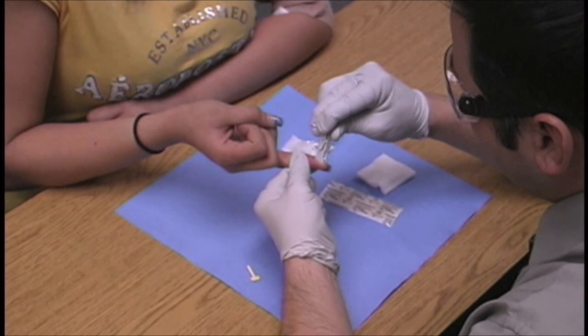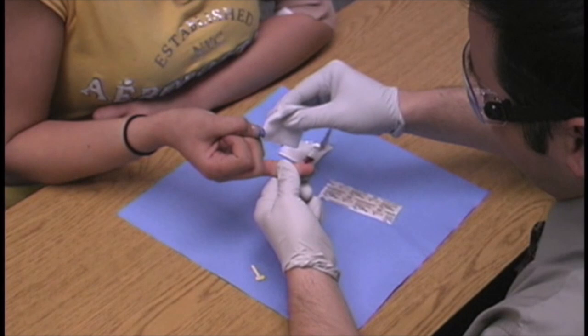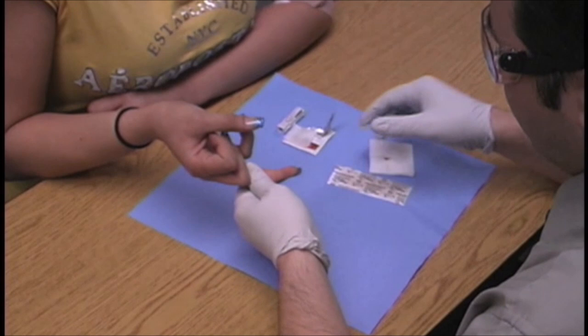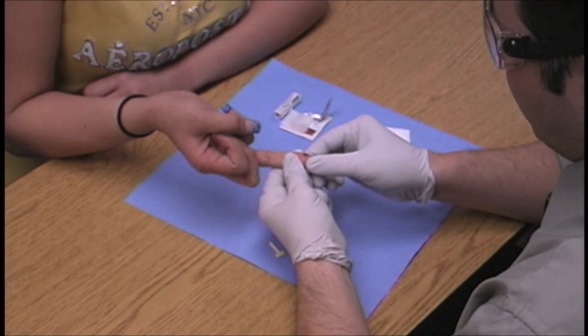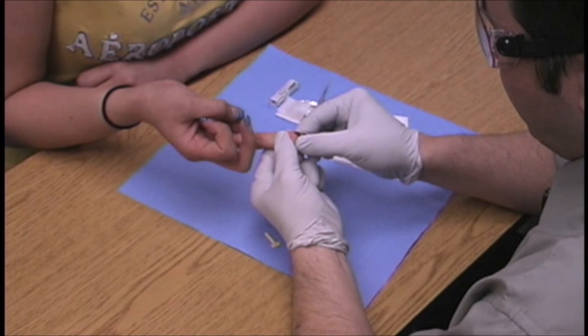The needle goes into the finger and retracts. Al squeezes to get the first drop of blood — remember, the first drop contains tissue fluid — and he wipes away that first drop with a gauze. He then supports the finger with one hand, starts at the base with the other, and pulls up to get a large drop. Once he gets a big drop of blood, it can be placed on a reagent strip, in a capillary glass tube, or on a slide — there are many dispositions for this capillary blood.